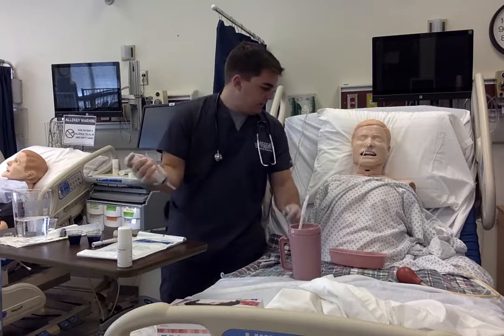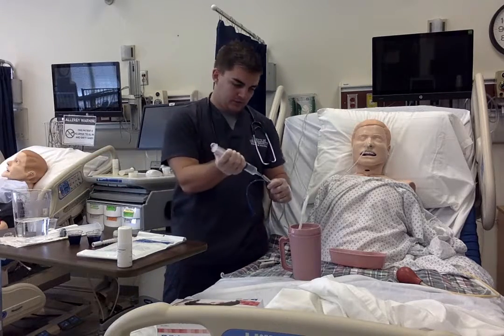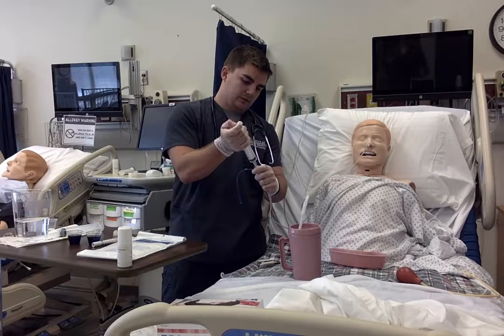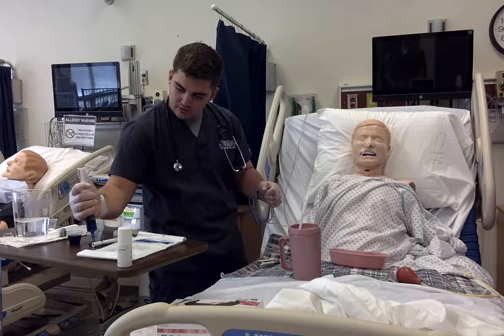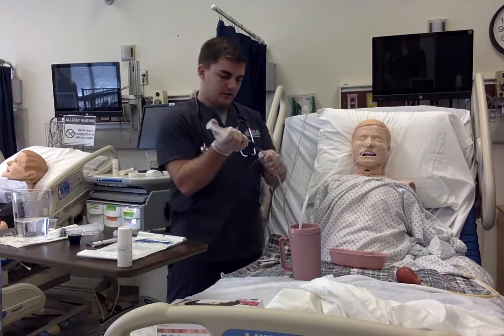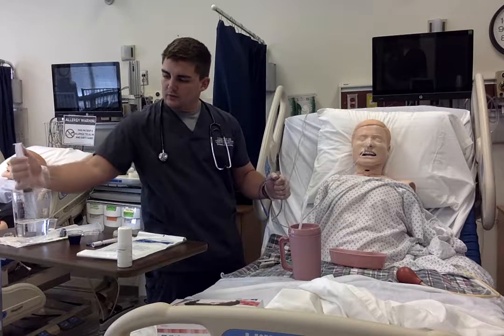Prior to doing this, I would grab the tube and flush it with 20 mils of water to make sure that the tubing is patent. Remove it and get my medications. My first medication. Getting all the medication, and then instilling the medication. Removing it, and then flushing it again with 20 mils of water.